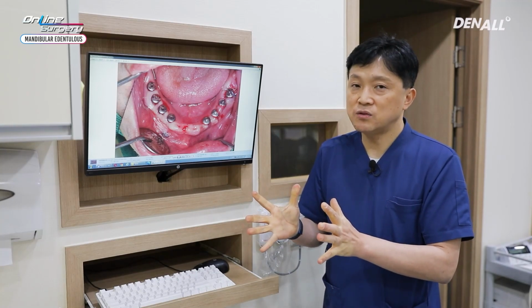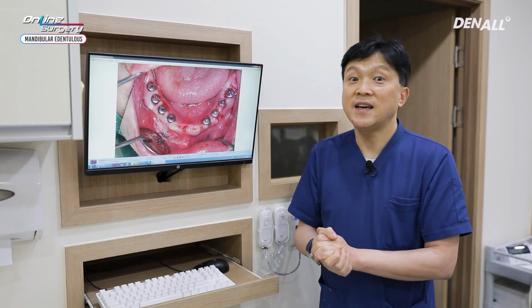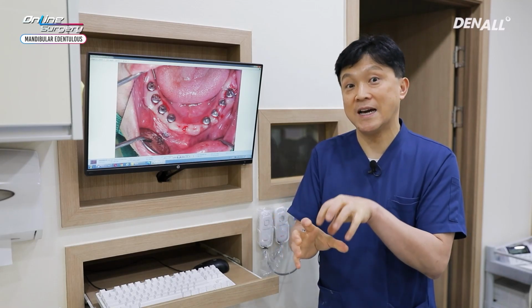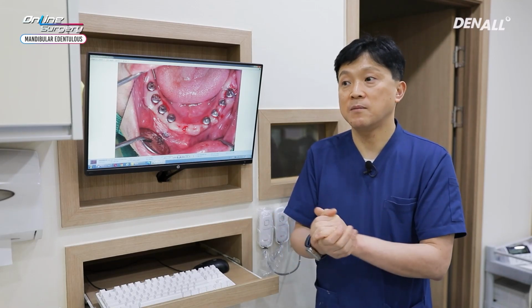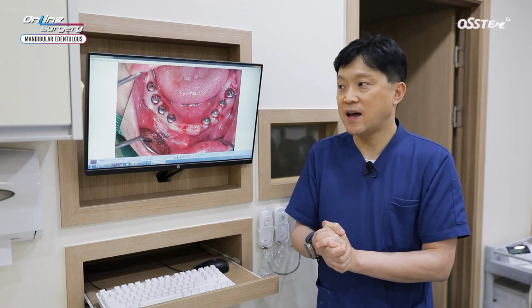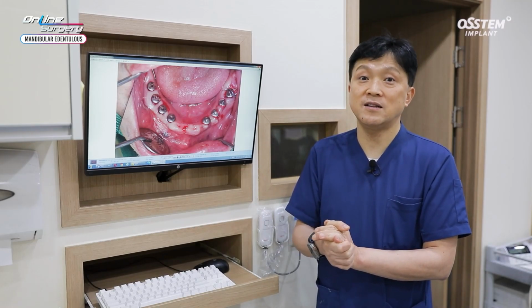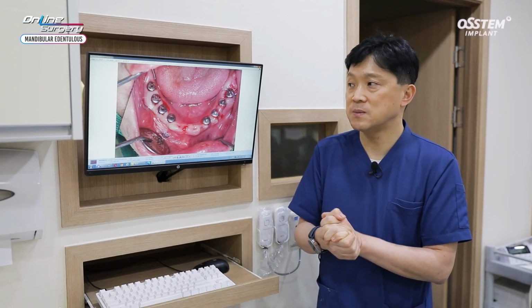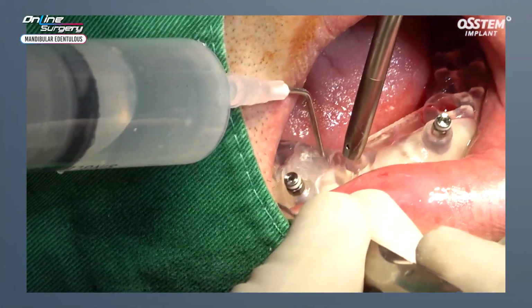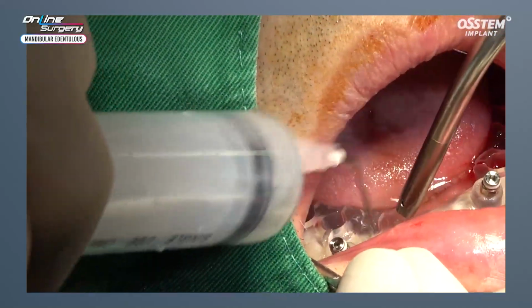When you do guided surgery, one of the problems we face is that some people may feel that irrigation is not done properly all the way because the template hole is small and irrigation is done only through the hole. You may worry about heat being generated. In my opinion, I don't think heat will be generated, but there can be excessive bone chip because irrigation is not done properly. As shown in the surgical video, in between drilling, you need to do irrigation in order to remove bone chip within the drill hole.